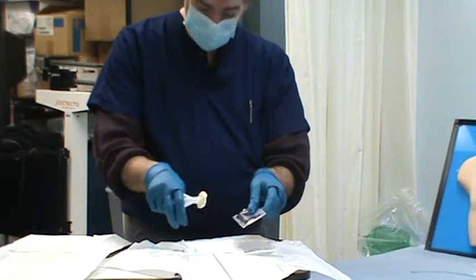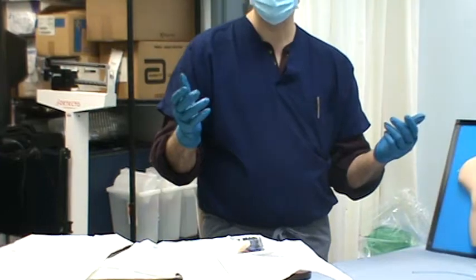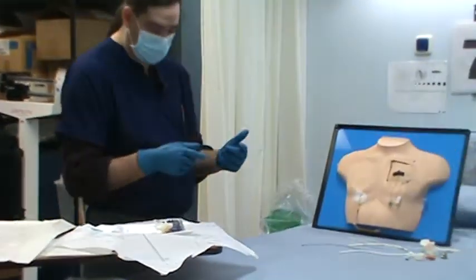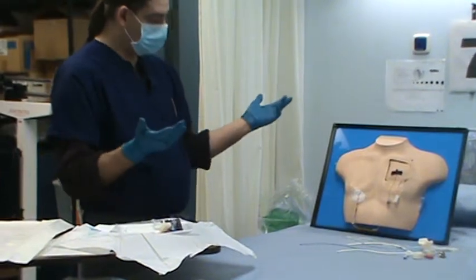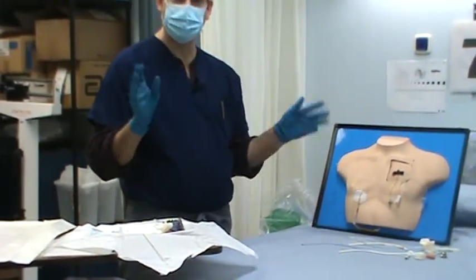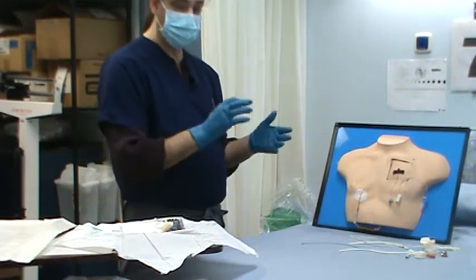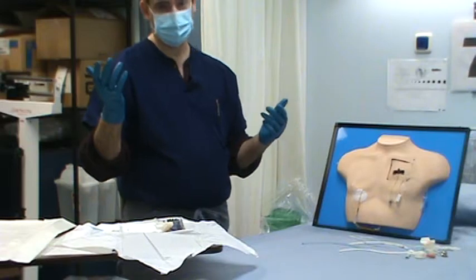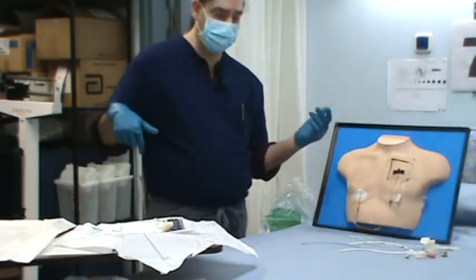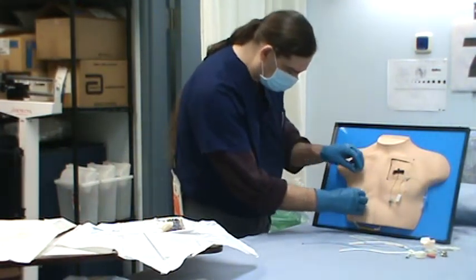Now once again, when you're doing this, you could say oops, as long as you've got a way to remedy it. I'm looking at this patient, I'm ready to do my dressing change. Oh, by golly, look, there's a dressing on there and I've got to get it off and I've got my sterile gloves on. What am I going to do? Well, I should have taken that off with clean gloves and then put my sterile gloves on. But no harm, no foul. I've got an extra pair of gloves here. I'm going to go ahead and take this dressing off and then just put on new gloves.